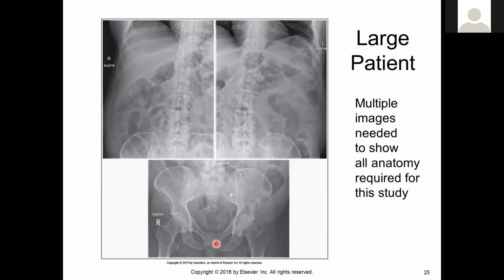On the lower portion, we have more below the pubic symphysis than we need, but look at these bright metallic objects. These are landmarks for you to compare to the other images. You can see they're visible on the other 2.